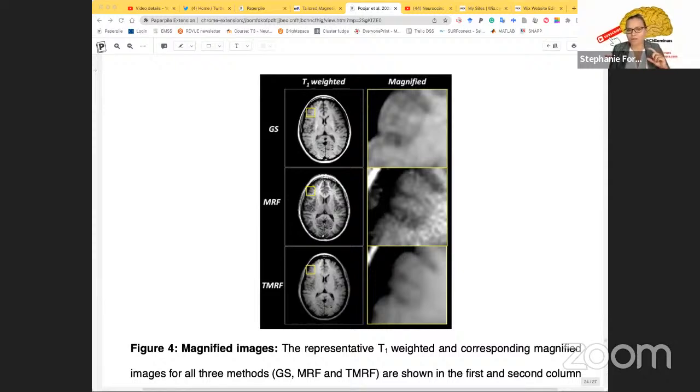Then they applied a sliding window approach to detect signal constancy in a given contrast window. They used the 749 time points to tailor the evolution of the magnetization properties for the 4 types of tissue: the white matter, the gray matter, CSF, and fat. But that's as far as my understanding of the methods goes in terms of tailoring it.